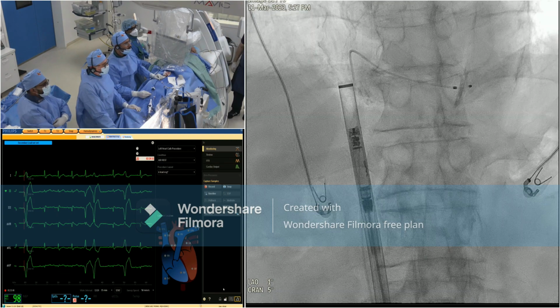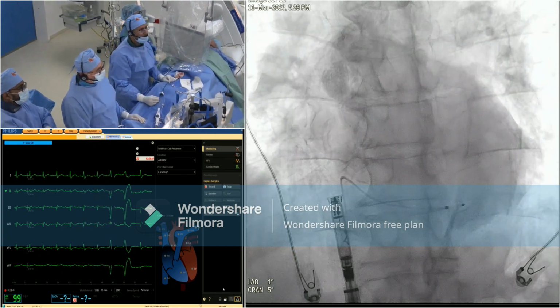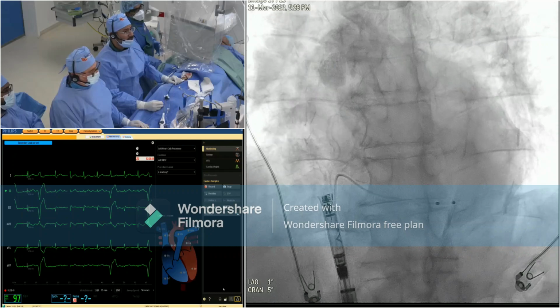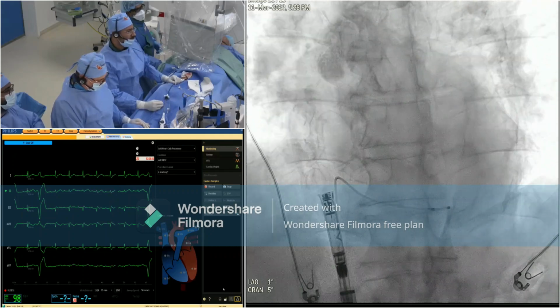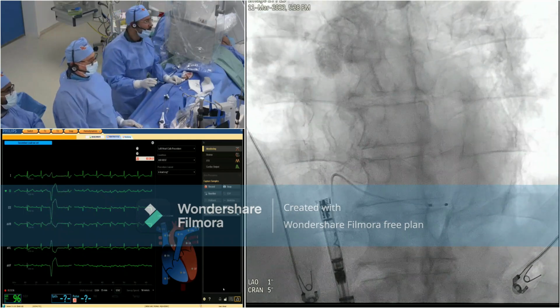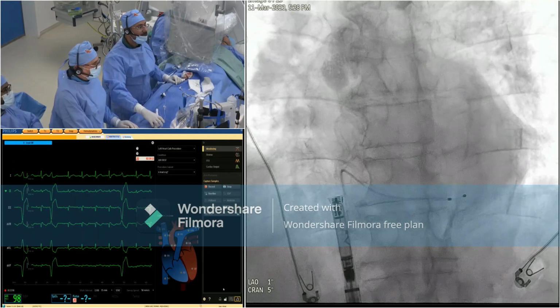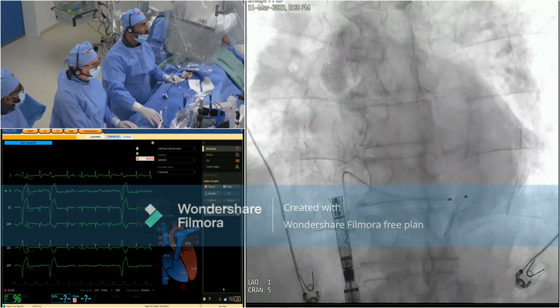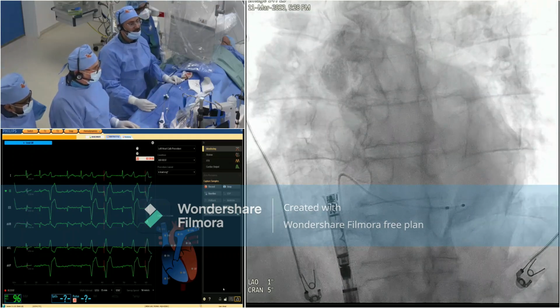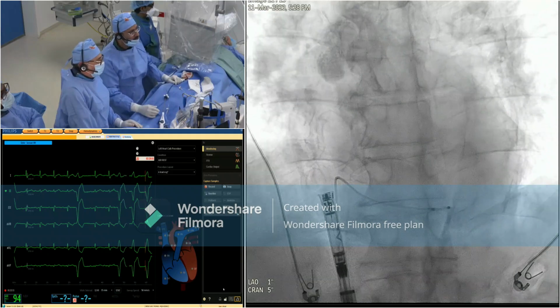Dr. Mohamed Mu'taz Zaki with you from the panel. Just leave it there. Okay, please. So what is the echo for this patient, his ejection fraction? He has a normal ejection fraction. Okay. We don't put leadless in a patient with impaired ejection fraction, because simply we will not allow VVI pacing in a patient with impaired ejection fraction. So unless the patient has a good ejection fraction, you agree with me? I agree. Yeah. So please.